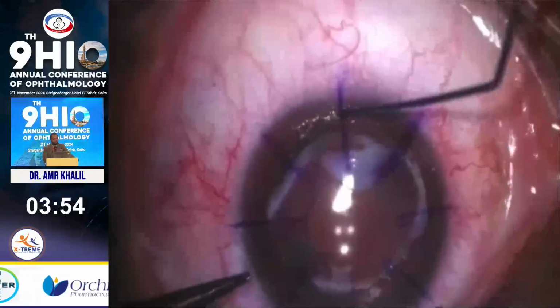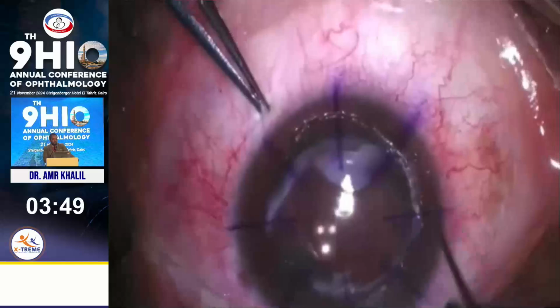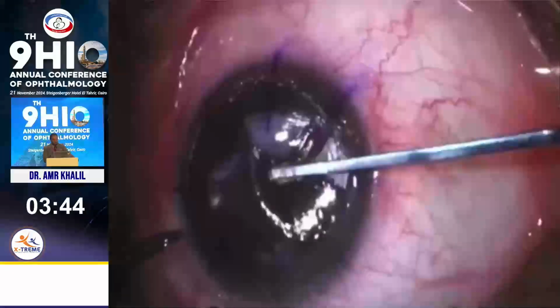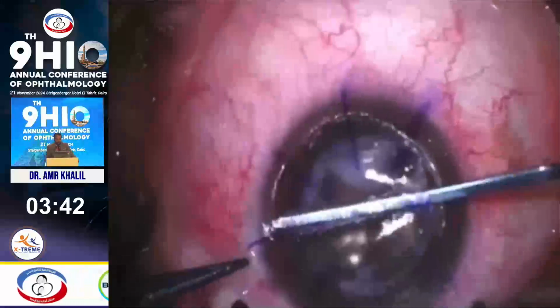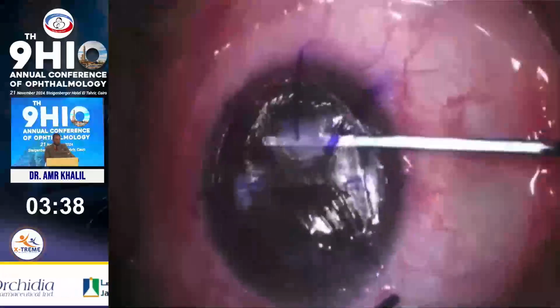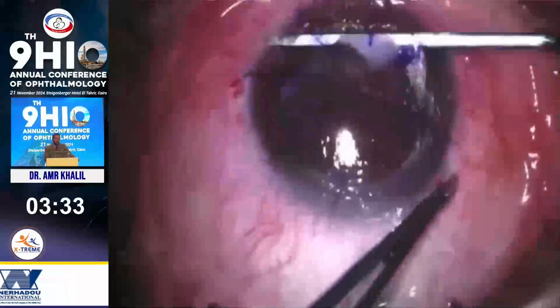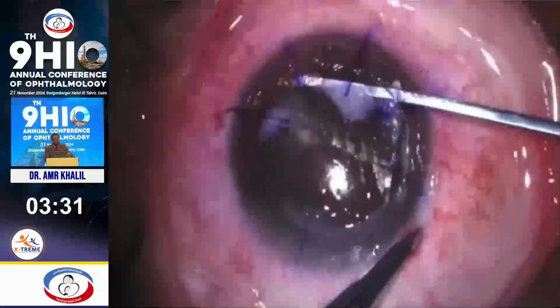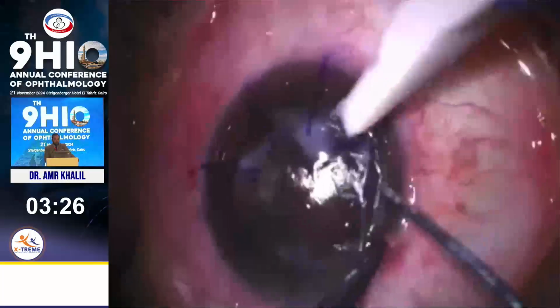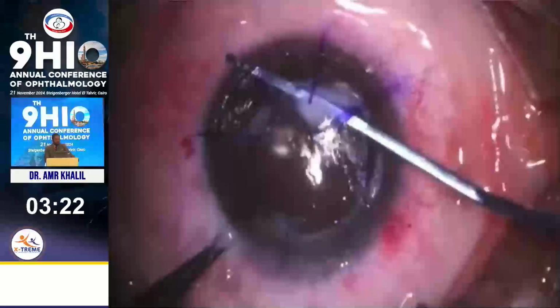Here I am intending to elevate only the 180 degree part which involves the ingrowth, not elevating the whole flap. Then, using a cyclodialysis spatula, I am trying to dissect the flap from the underlying stroma. Be careful and take your time in this crucial step. Most importantly here, push down toward the stroma during dissection, so as not to make a hole in the flap.